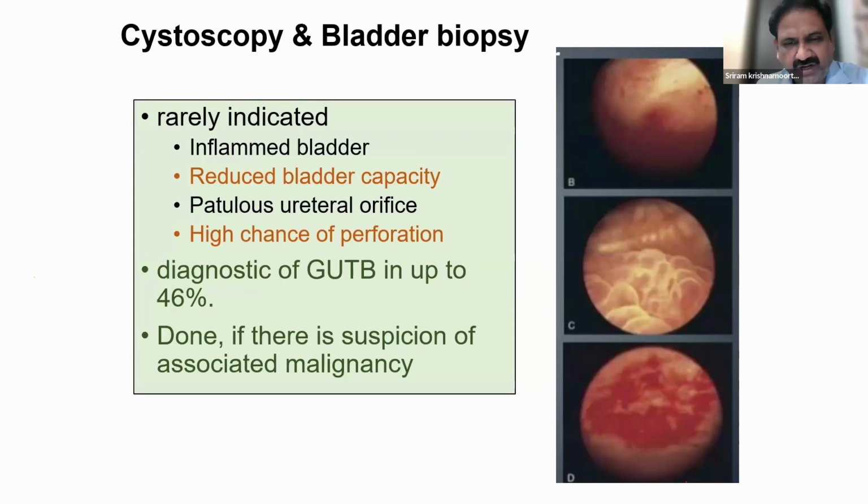Or you should take a 24 or 26 continuous irrigation channel and do a cystoscopy for that matter. Okay, so wherever there is a need, wherever there is a doubt, you can always do a cystoscopy with utmost caution, because over distending the bladder can sometimes produce a red glow, after which documenting the findings will be extremely, extremely difficult. Next slide, please.